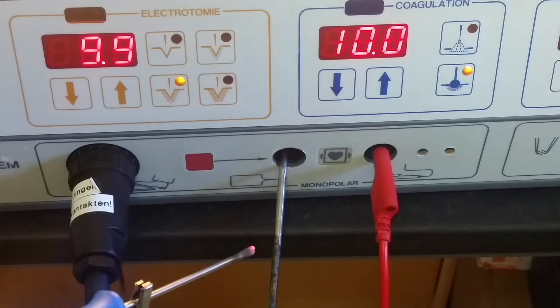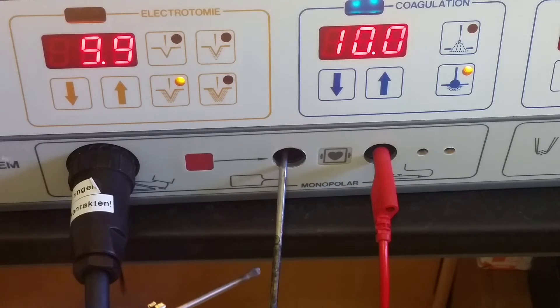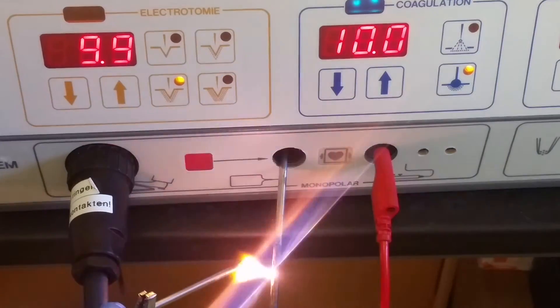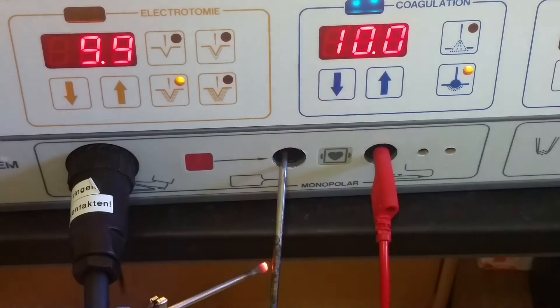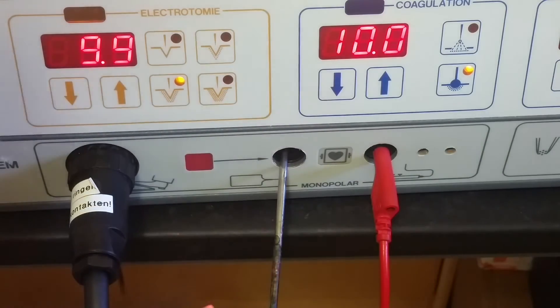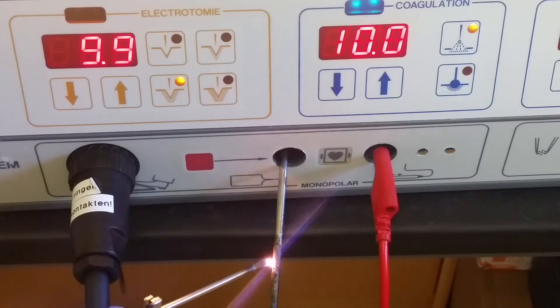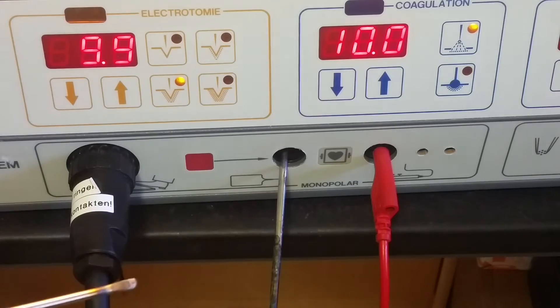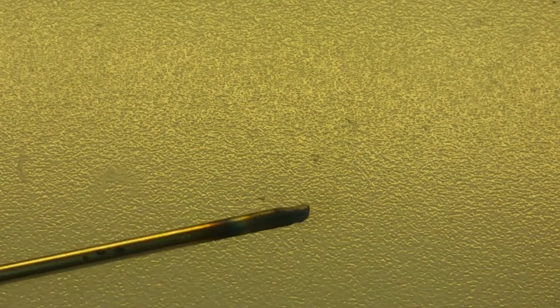Let's test coagulation. This is a bit more high voltage - you can see the arc begins like one and a half millimeters away from the rod. I don't need to touch the rod. Let's test the next setting - yes, that's high voltage. There's a high frequency output; it's not DC, it's high frequency AC. It ruined my screwdriver.